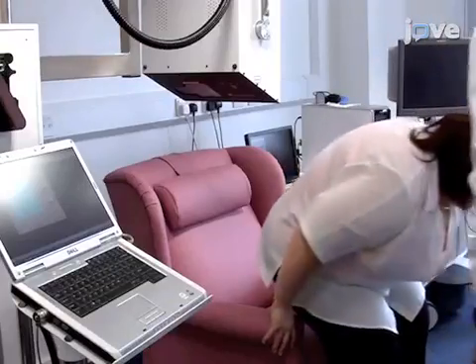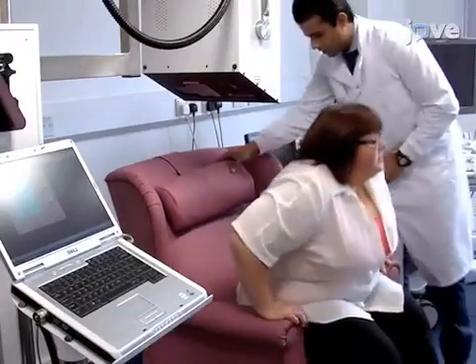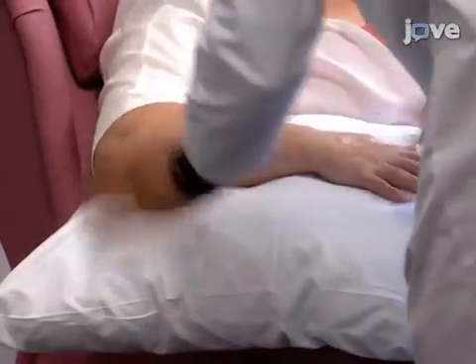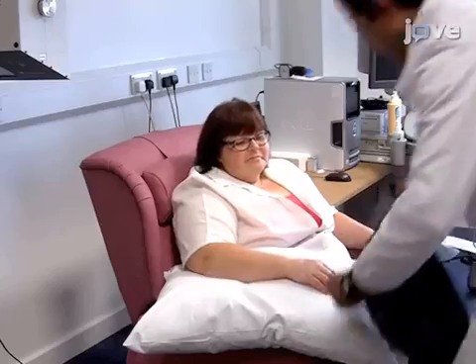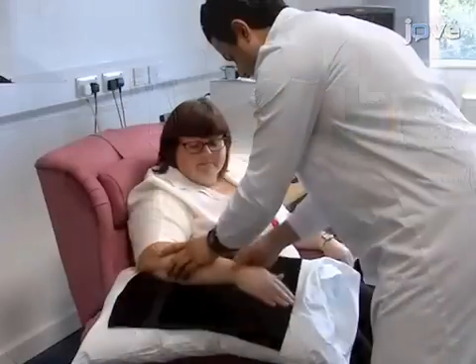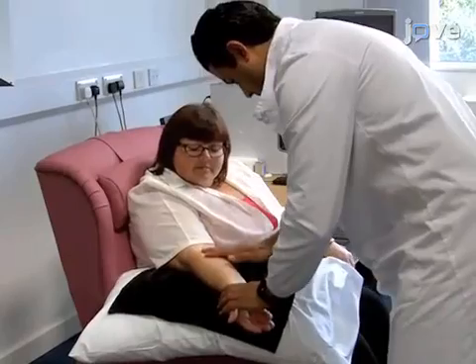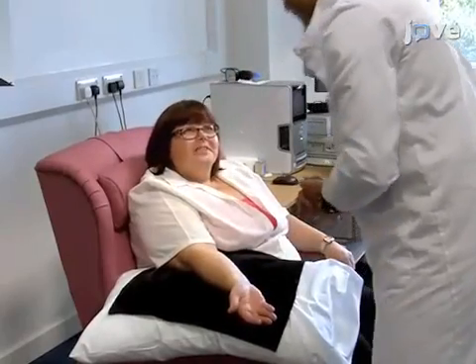Then bring the study participant to the imager. Seat the participant slightly reclined and on a firm pillow with one elbow bent at 90 degrees and that forearm comfortably positioned on a black mat. Be sure to secure the forearm to the pillow so that it stays in place on the mat.